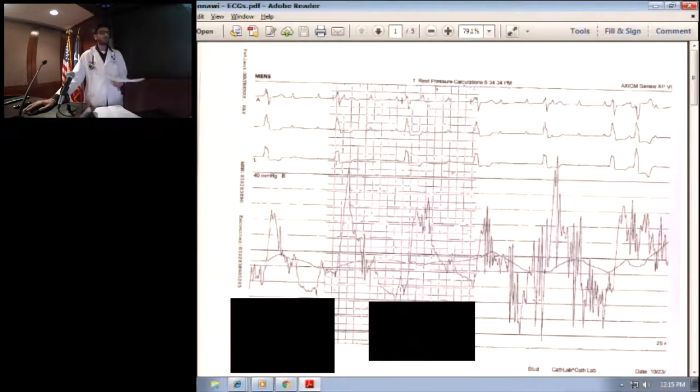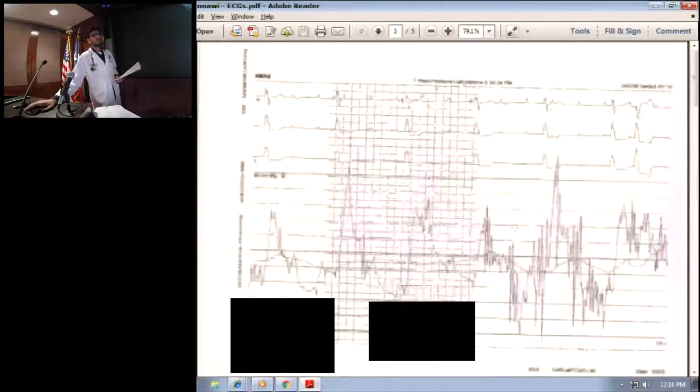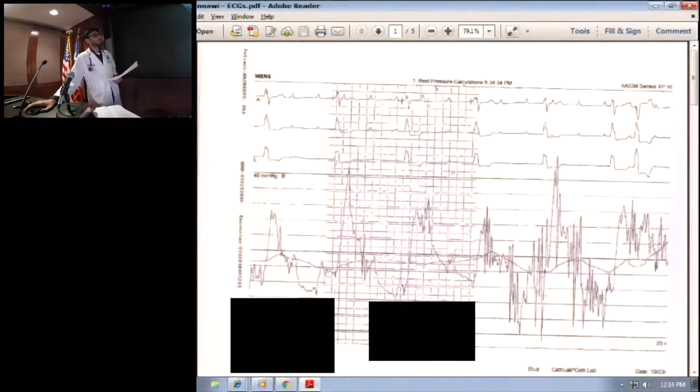Just one point from this: the report was 15 systolic, 10 diastolic, and the mean was 19. If you read that, you go to the physician documentation files, and those numbers are there. This happens to all of us. We put in numbers. Just be sure that we're putting in accurate numbers, especially the mean. Be sure to double check the mean.